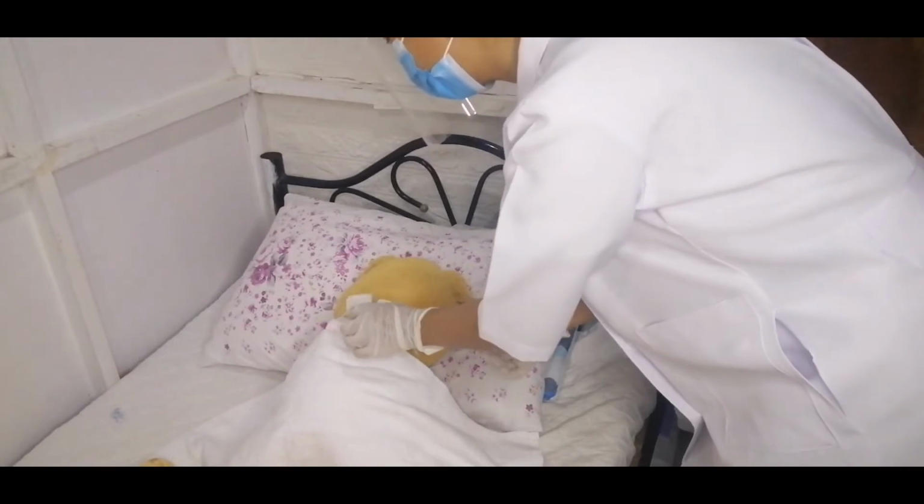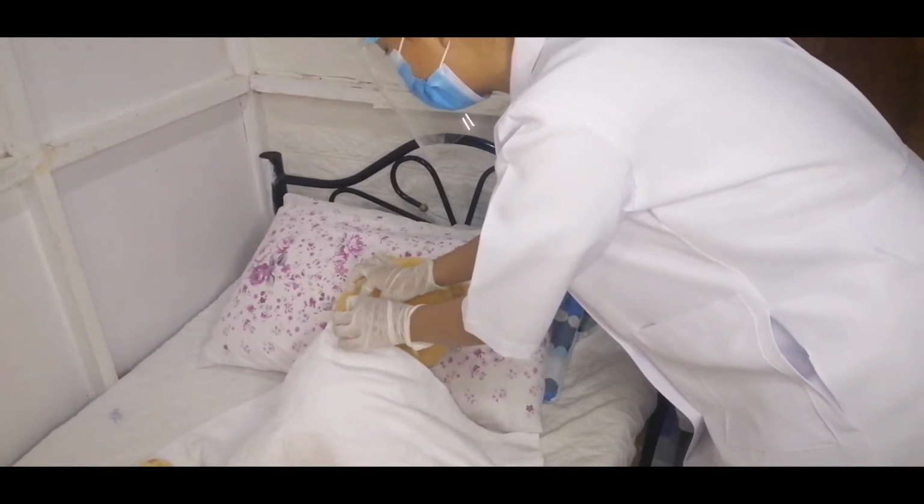Cleaning the tracheostomy. Remove oxygen source if one is present. Stabilize the outer cannula and faceplate of the tracheostomy with your non-dominant hand. Grasp the locking mechanism of the inner cannula with your dominant hand, then press the tabs and release lock. Gently remove inner cannula and place in first basin with plain NSS plus hydrogen peroxide, then let it submerge there for a few minutes. Hinga po ng malalim, hugutin ko na po.